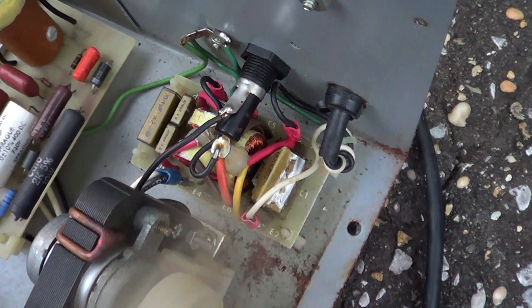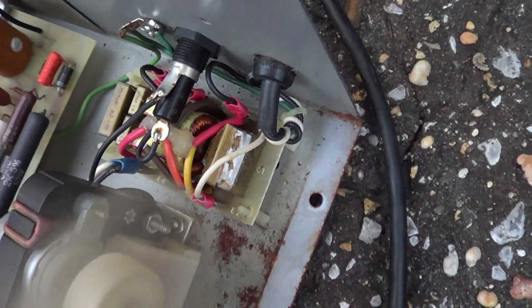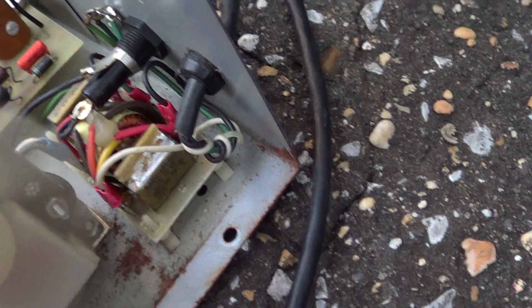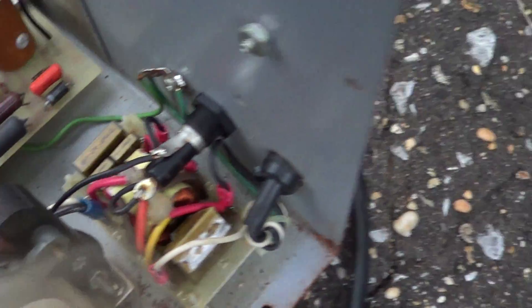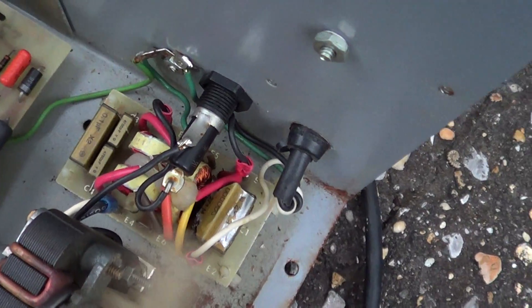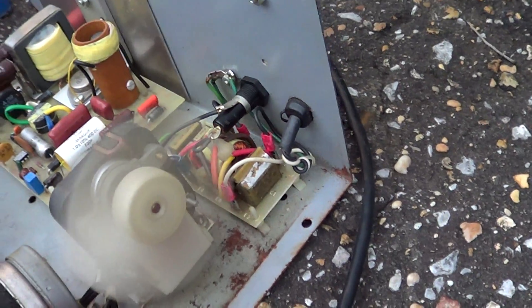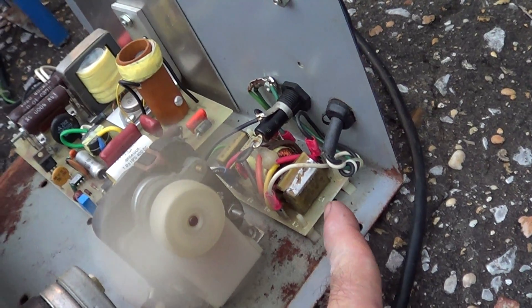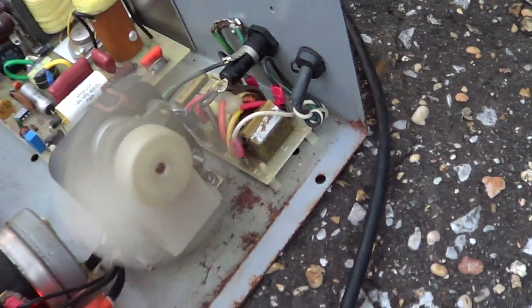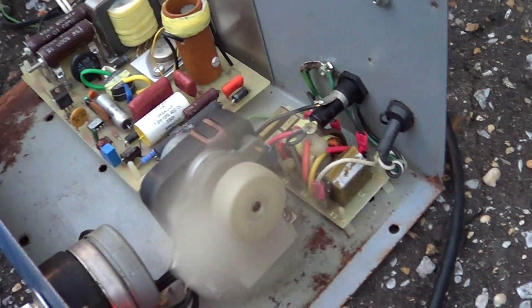It looks like it's got C4, C3, E4, E2, E1, and C1. Those E's are the connectors, and the other ones are just the inductors. So it looks like an LC network just to filter out trash, and for some reason that one — probably a polypropylene capacitor — decided to let go and spewed the whole place with a bunch of funk.